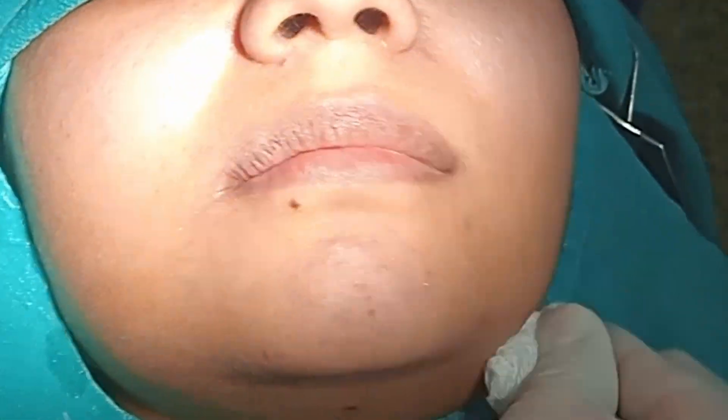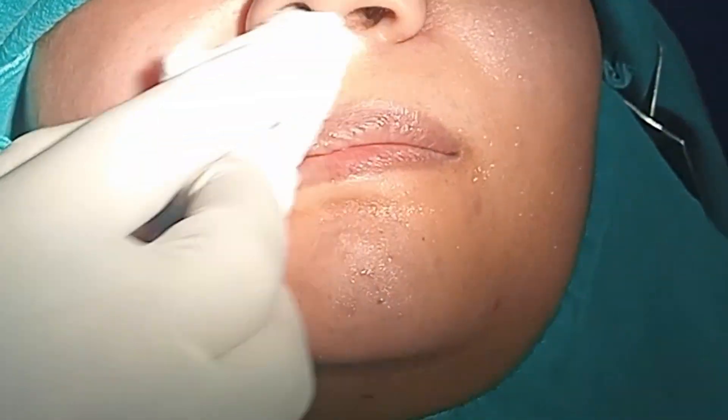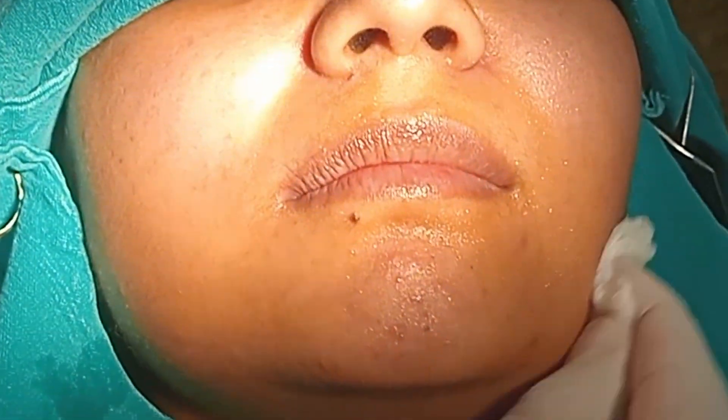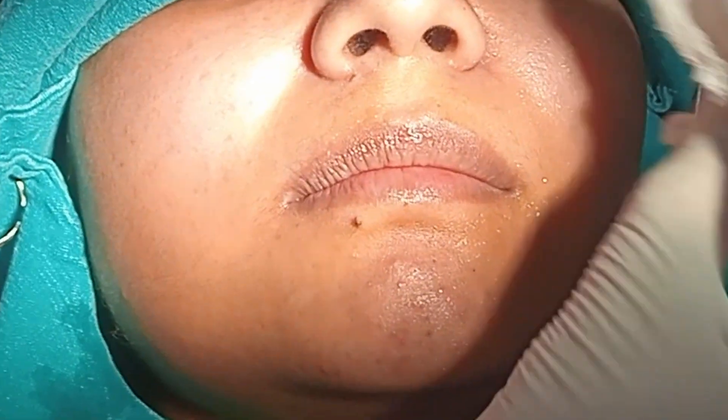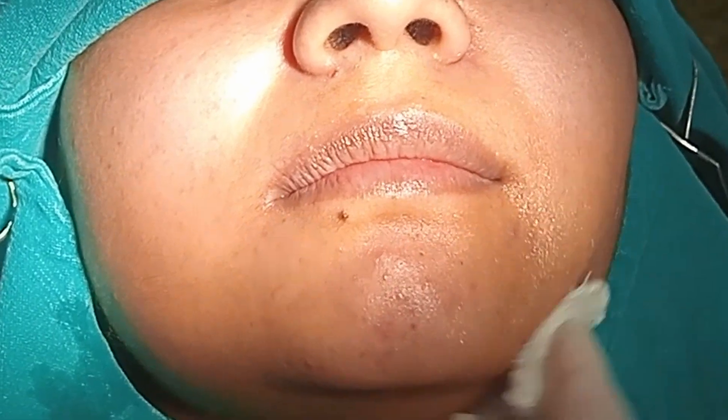Also make sure that there are no blood spots on the patient's face after the procedure. Here I am using saline-soaked gauze to clean the patient's face.